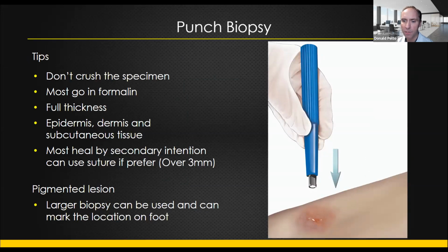So here's an example of a lesion, an example where you would do a biopsy. Go down and twist it. I usually go down straight, twist it, and then turn it to the side a little bit and push it a little bit so it'll pop out.